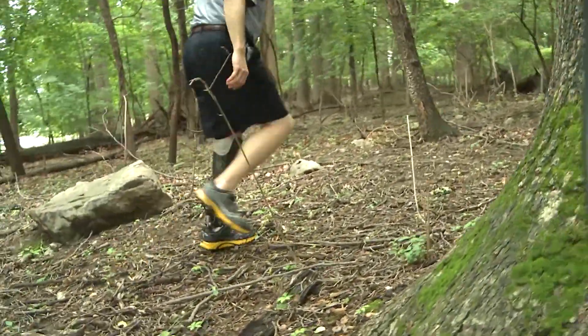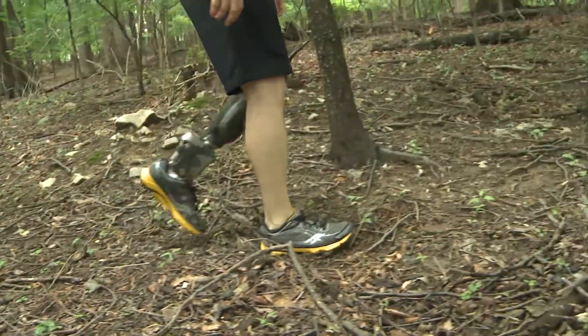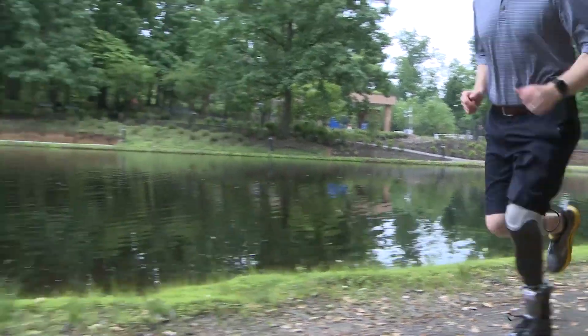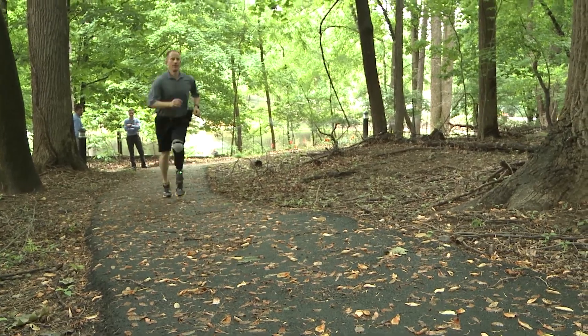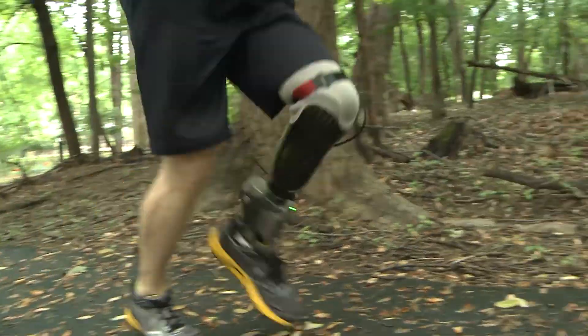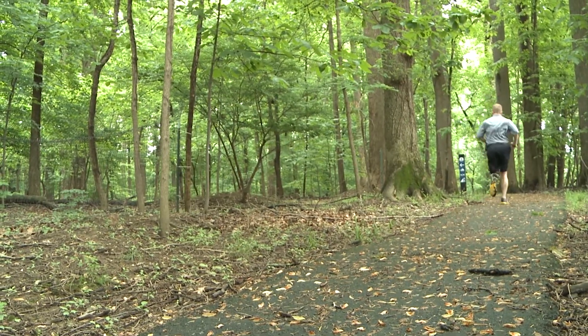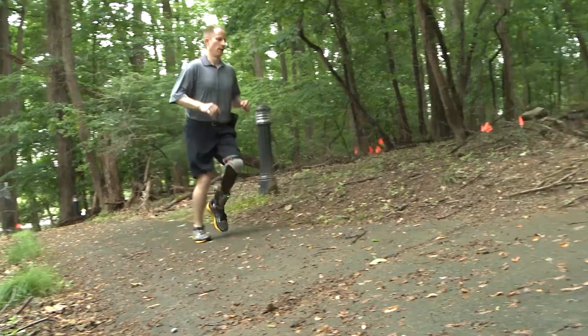You can also transition activities in real time. 500 times a second you're looking at what the tibia is doing. So you can transition from a walking step to a running step within the step. This is happening continuously, and we're not looking for gait activities within the step — we're not trying to detect heel strike, foot flat, or toe off. We're just looking at what the tibia is doing.